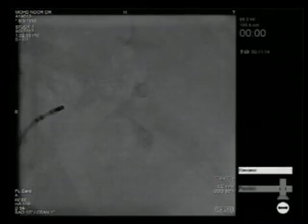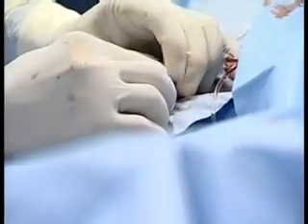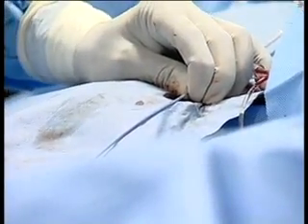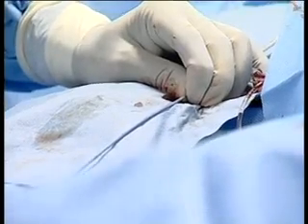Dr. Narasimhan, this is Dr. Soumitra Rai. Yes. As you were mentioning to touch the posterior wall of the renal artery, I think along the length of the renal artery, you are touching the different portions of it, posterior, anterior, superior, and inferior in turn. You are taking it in a spiral fashion, isn't it? Yes, that's right. So that you don't deliver circumferentially in the same plane. You deliver it at different planes. Go ahead.